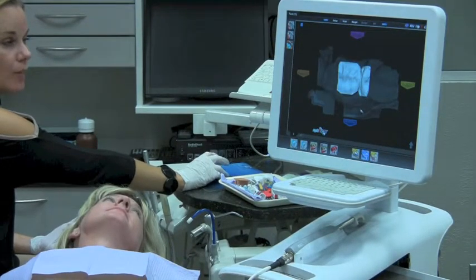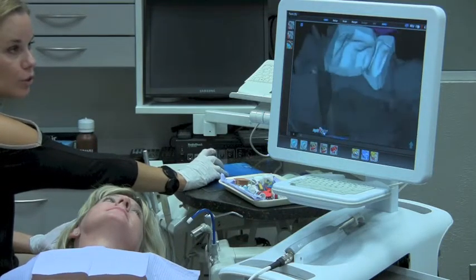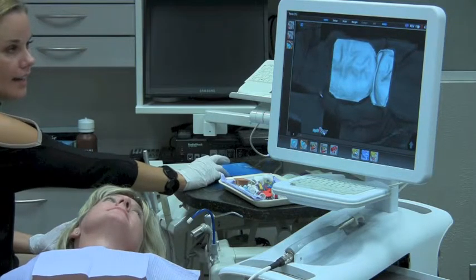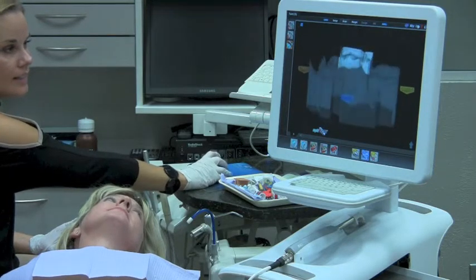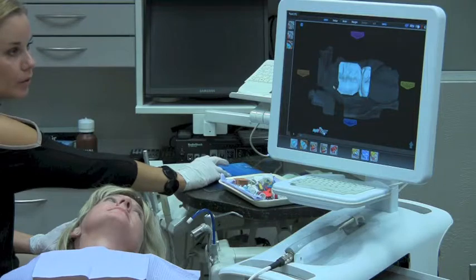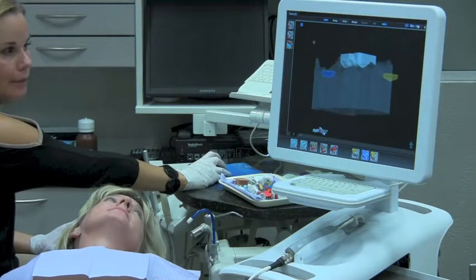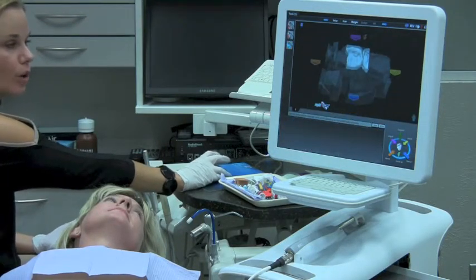Now I've selected my opposing tooth surface — I can rotate this and take a look at it. I have the ability to trim it if I need to. So if I selected too much area, I can trim that area off and take a look at it again and trim a little bit more if I need to. Now I'm happy with my opposing selection area and I'm ready to move to the margin tab.